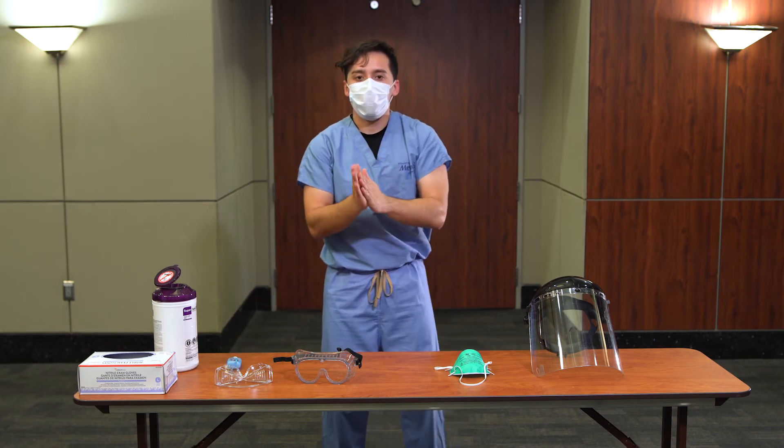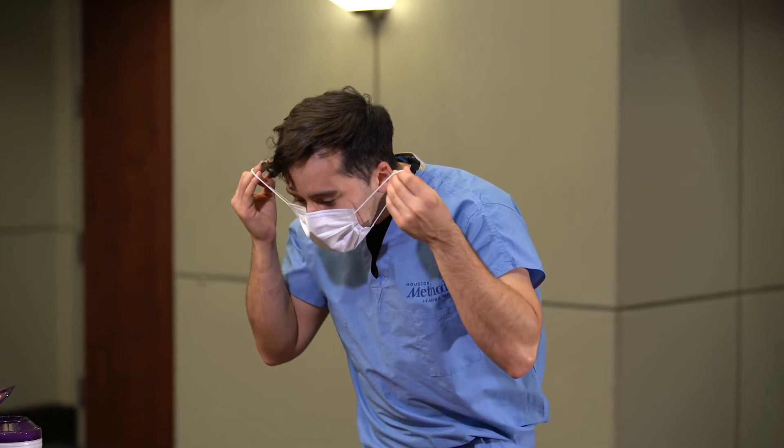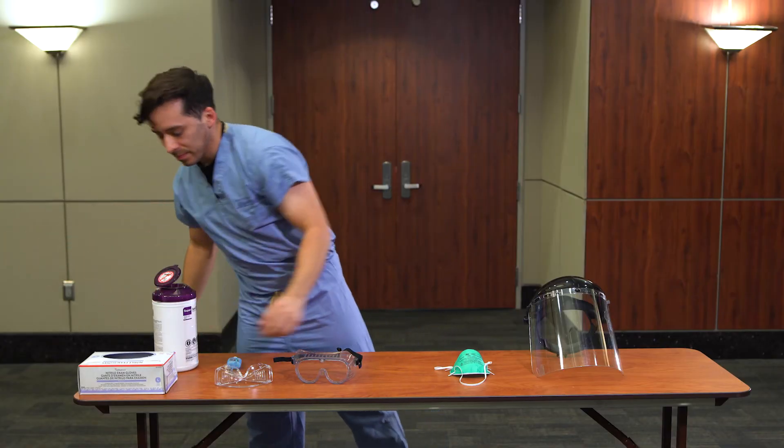Doff the mask by leaning slightly forward. Use both hands to grab the ear loops or untie the ties. Pull the straps to the side, slowly remove the mask from your face, and discard. Perform hand hygiene.